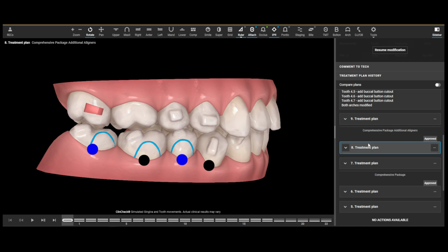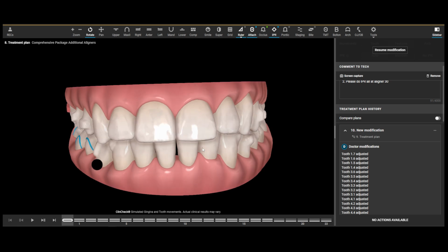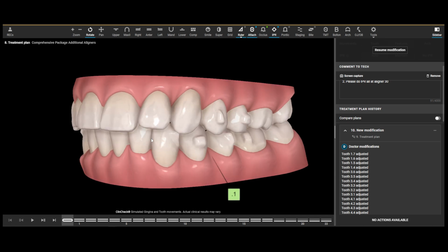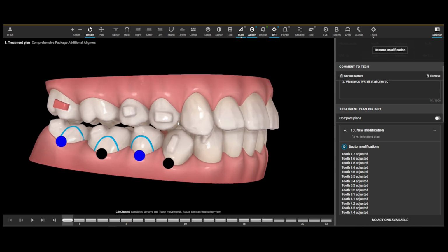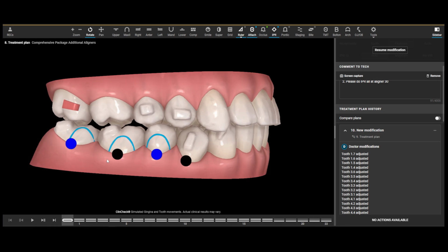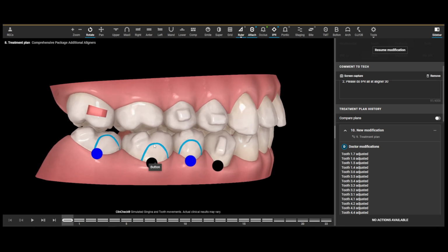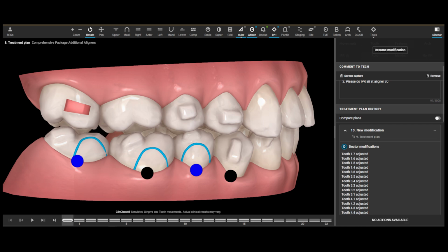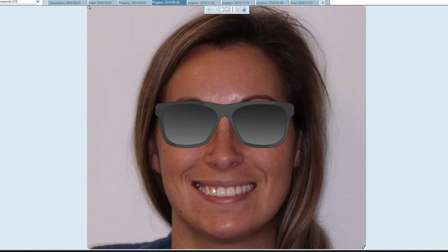So we just get another plan, but for the most part, I don't really care as much now about the movements. Like everything's pretty straight. Maybe the lateral needs to tweak and that lower premolar needs to rotate a bit more. No biggie. And we just do that with our new round of aligners. But what I care about the most is, again, getting those elastics to push up against the occlusal surface and continuing to intrude those uppers because on our plan, we're not there yet. She's still not quite happy. So that's the plan that you just saw. So we just keep using the elastics and intruding.